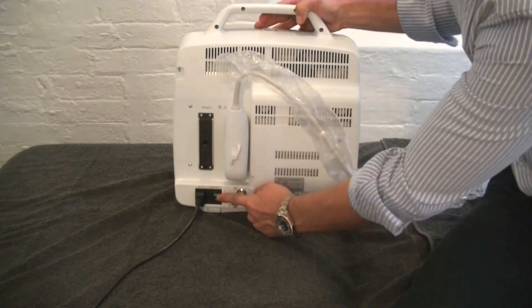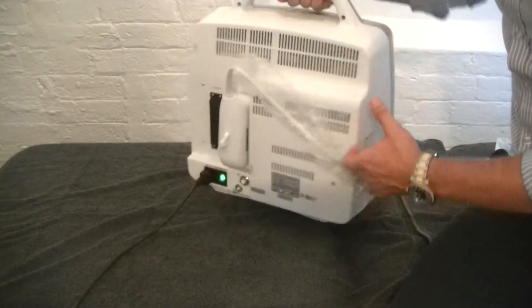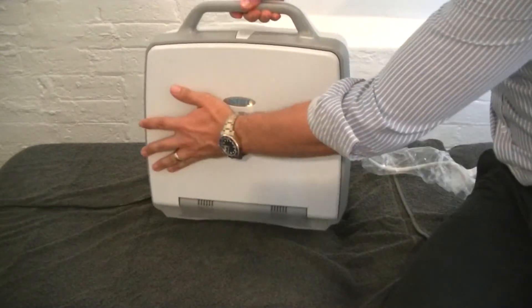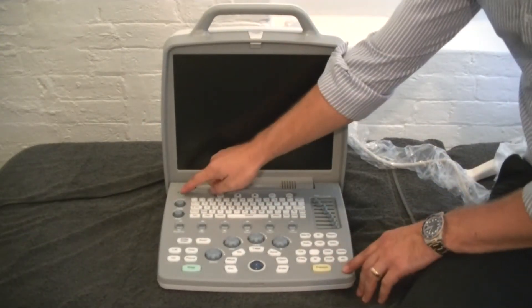The power button is here at the back, and to turn the unit on there's a button on the front.